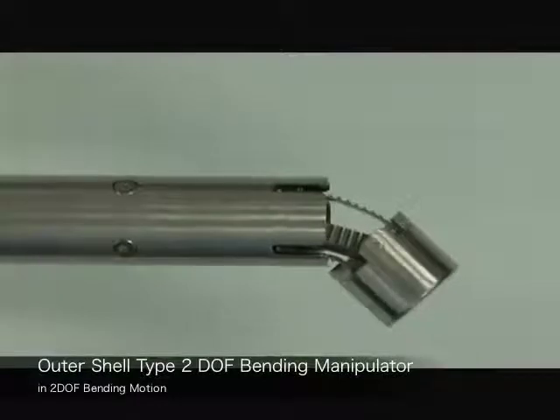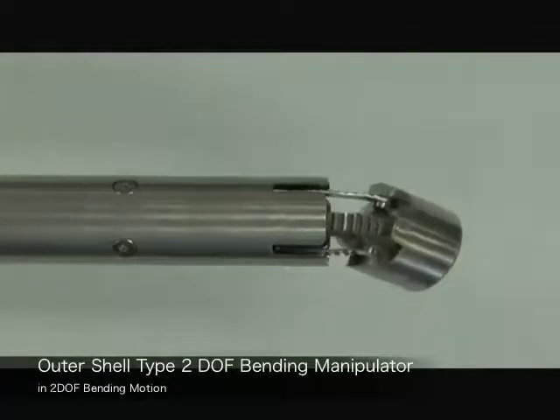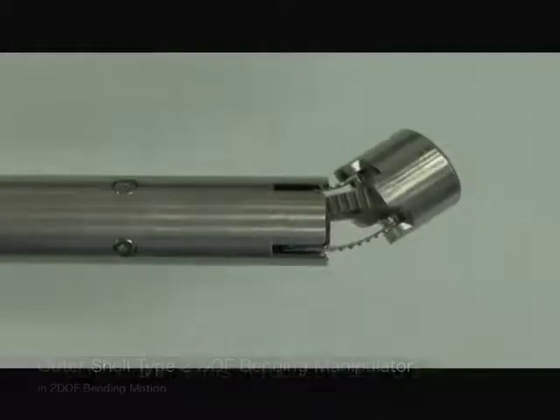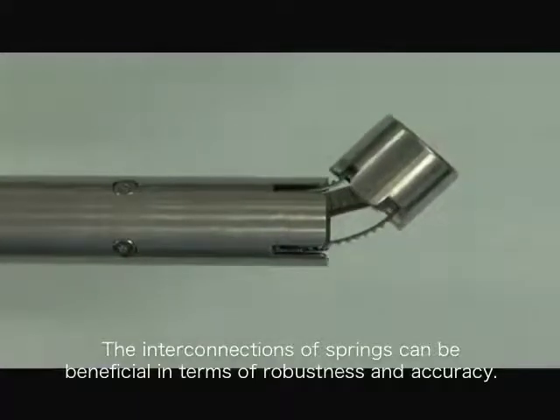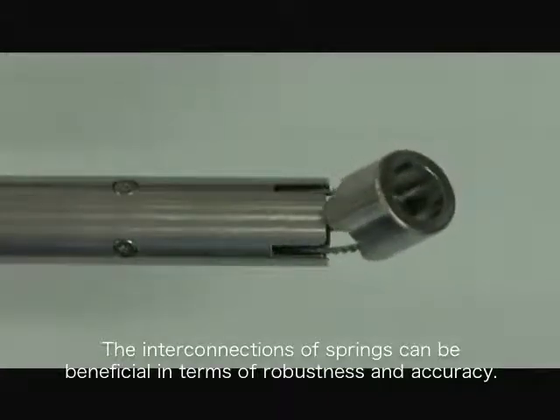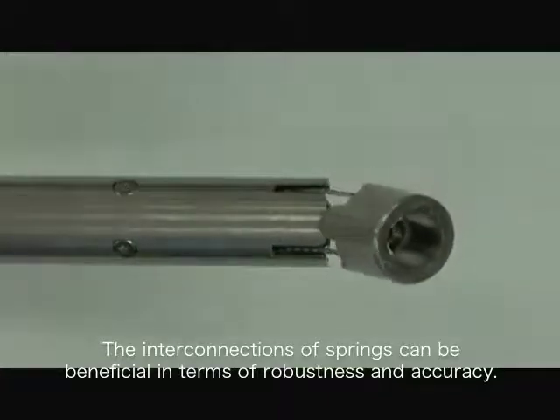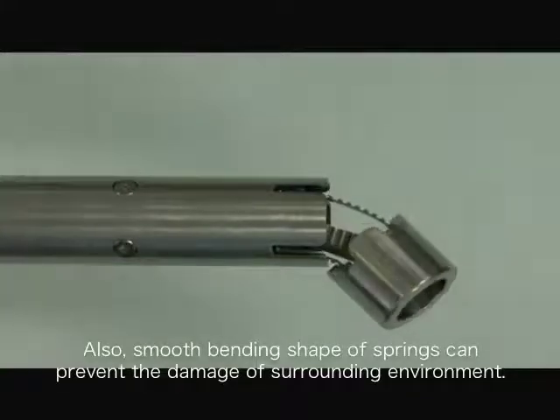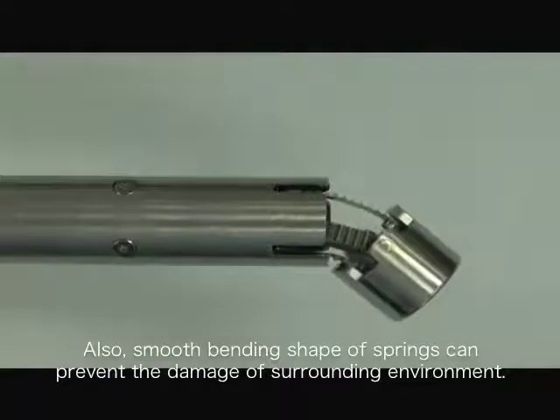Here is the 2 DOF bending motion. The interconnections of springs can be beneficial in terms of robustness and accuracy. Also, the smooth bending shape of springs can prevent damage to the surrounding environment.